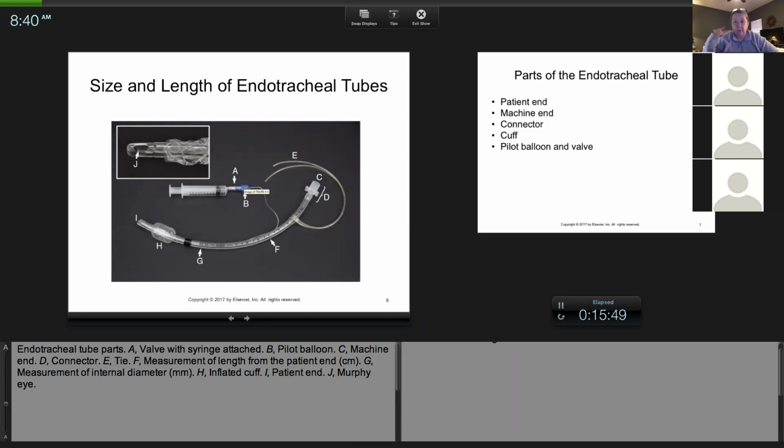I mean, sometimes you do have to go behind the ears, but most of the time I like to tie it on top of the nose, and I like to tie it behind the canines. So if the tube begins to slip, sometimes the canines will catch it, because it's happened in surgery where all of a sudden the patient is waking up.